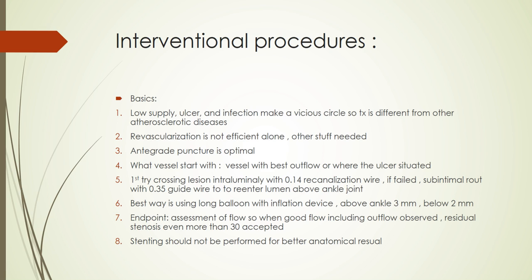The end point of our procedure is assessed by assessing flow. When good flow, including outflow, is observed, residual stenosis even more than 30% is considered acceptable.